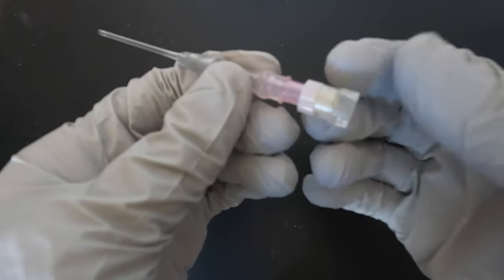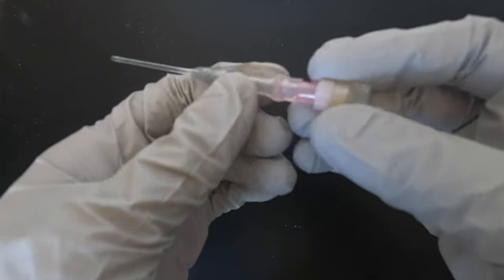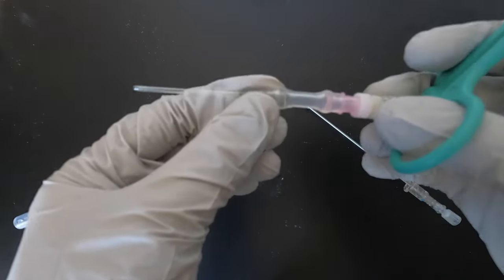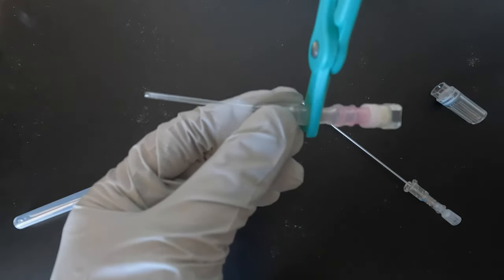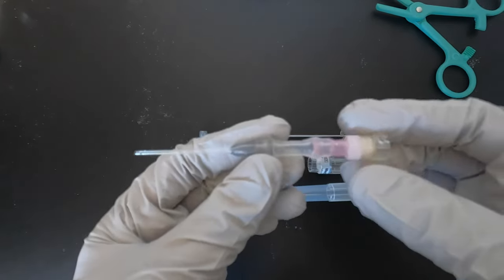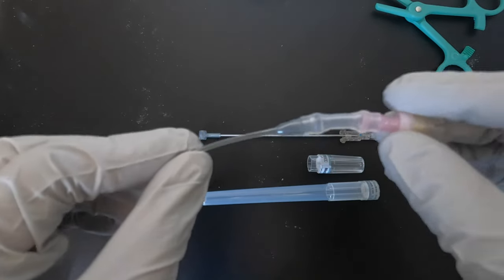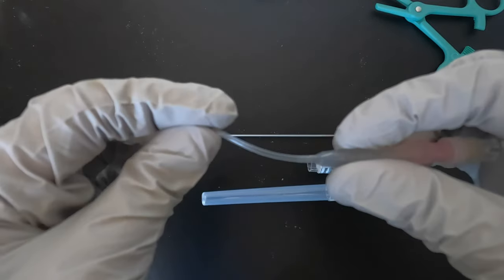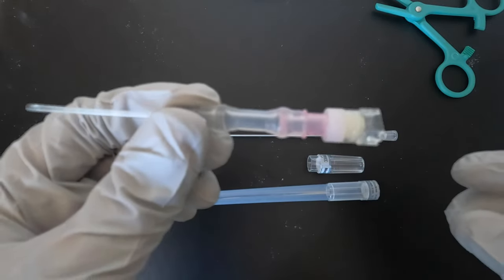Because it doesn't have a reflux valve, blood will usually flow out after the needle is pulled, so you need to clamp on this side. As you can see, once you pull out the sharp, you can even bend the plastic cannula inside the patient's vein. It's basically just like your IV cannula.